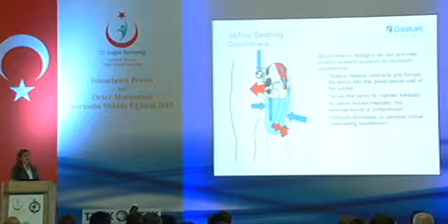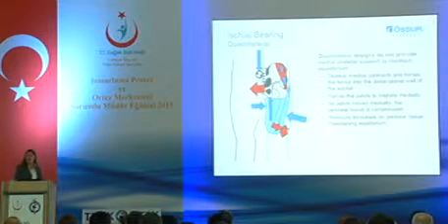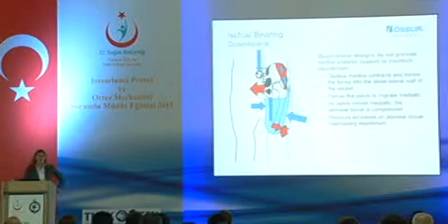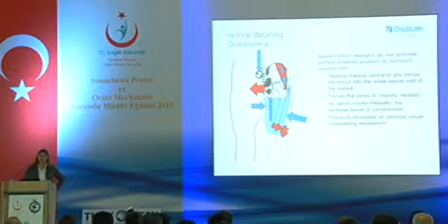So it's very common as the amputee puts his weight fully onto the prosthesis. Because of this, it's very common that we start to get a lot of gapping at the lateral wall in every single step as he walks.